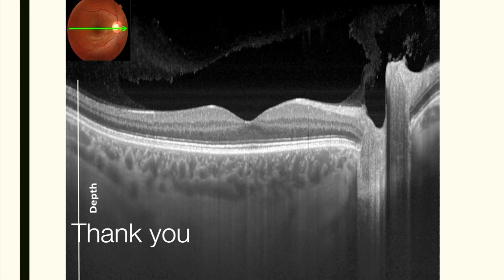So the deep plexus gets affected first. That is definitely there. But all your NVEs and all those things you are going to see more in the superficial plexus. And when you prognosticate, because I said ischemia, that deep plexus comes in the watershed between the blood supply to inner retina and outer retina, so that gets affected first.